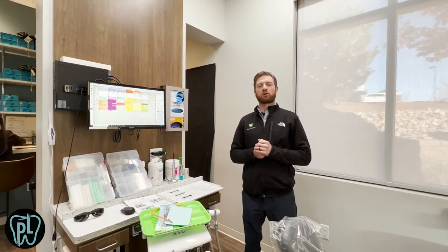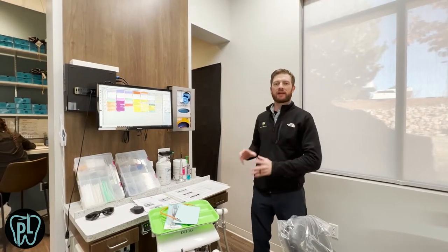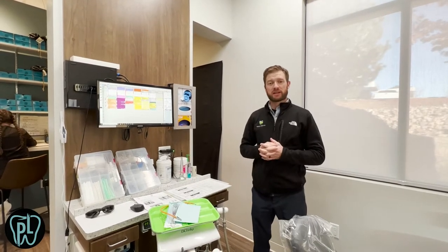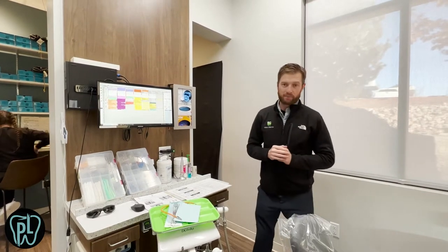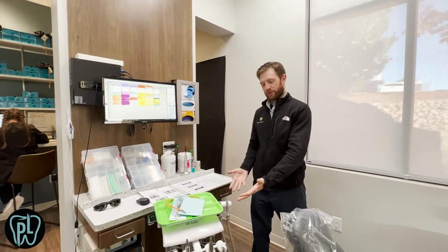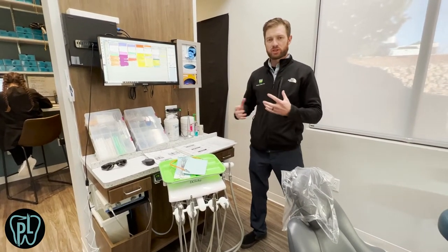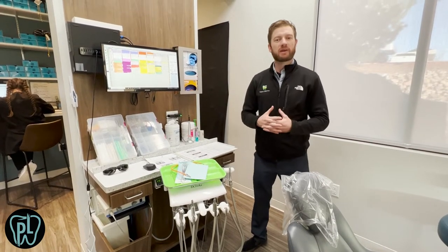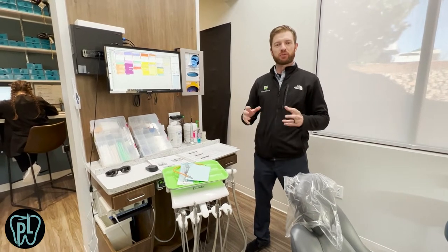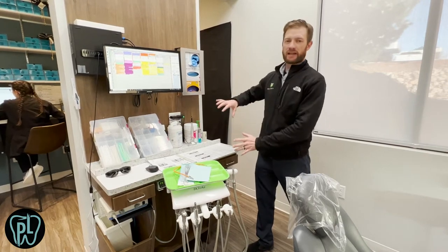Hey everybody, Chris Green here from the Practice Launchpad team. Today I want to go over this operatory design. I want to talk mostly about the 12 o'clock setup and then the IT setup with the monitors and how we went about that. There are a million different ways to do this, but the principles here can be customized to your preferences and will help you know all the little things to take into account when you set up the layout for your 12 o'clock.